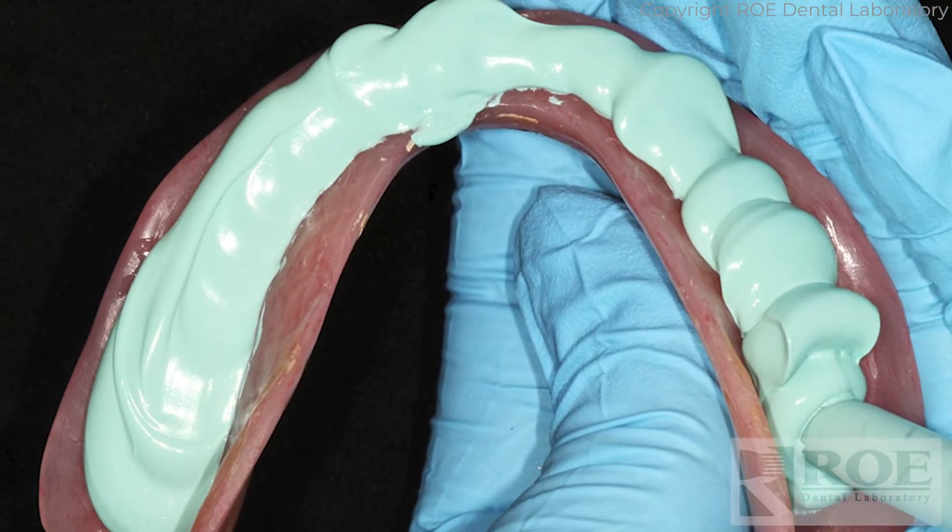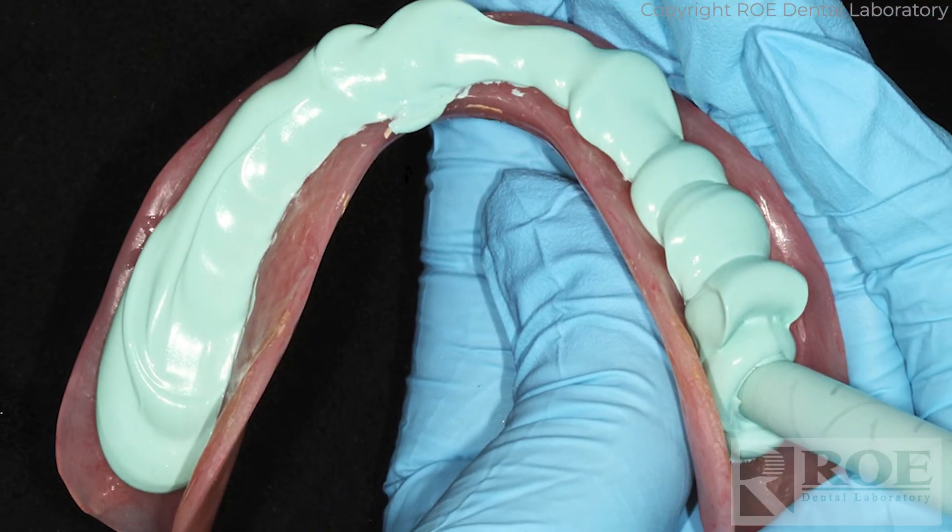For scanning duplicate dentures, the important thing is that it does not have a soft reline or any soft flanges — it all has to be acrylic, a solid denture. The only other material you can add is blue or green mousse.